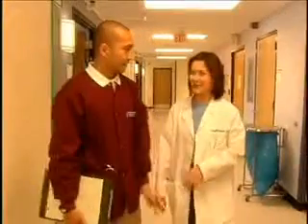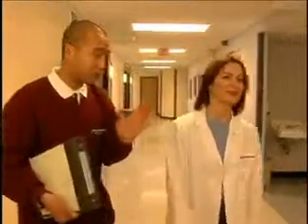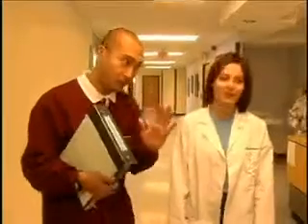Another unsure student. What is it with you guys? Must be something in the water. Of course you're right. I'm sorry. There's just concern about the possibility of giving someone too much fluid intravenously, which always makes me nervous. Why it's being given with a volume control administration set. Right. Why don't you gather your supplies and I'll meet you in the prep room in a few minutes.